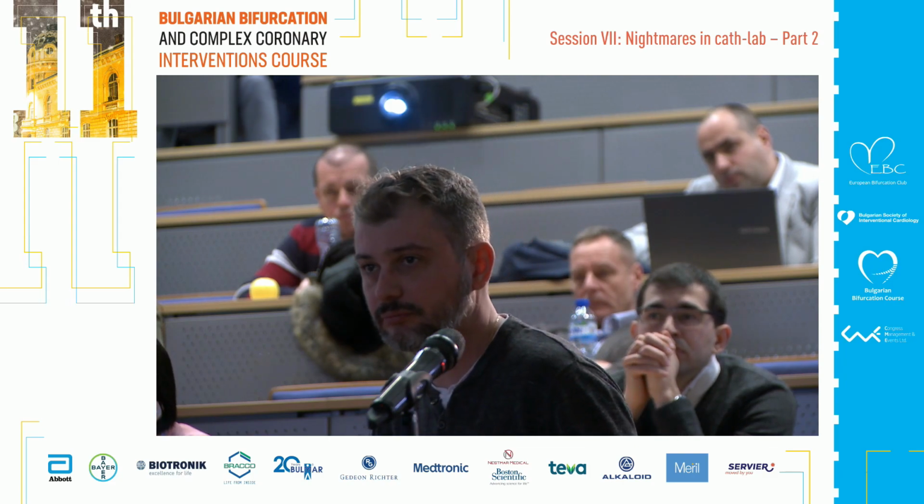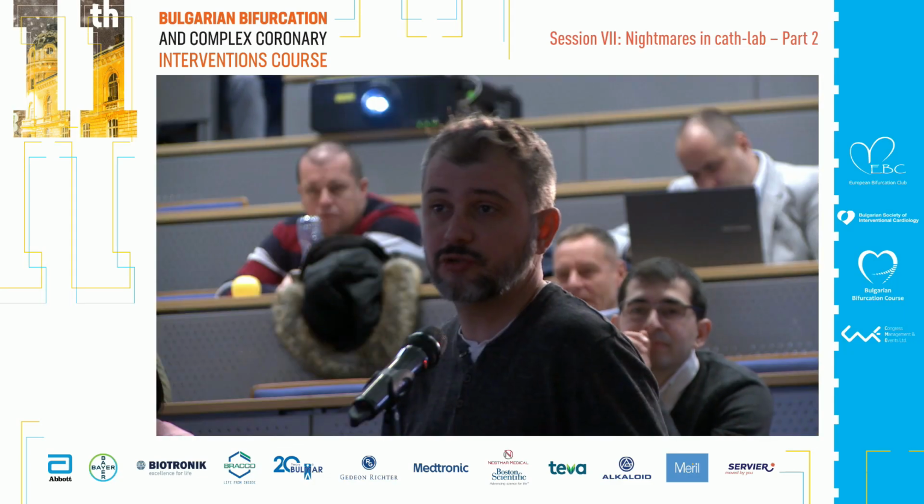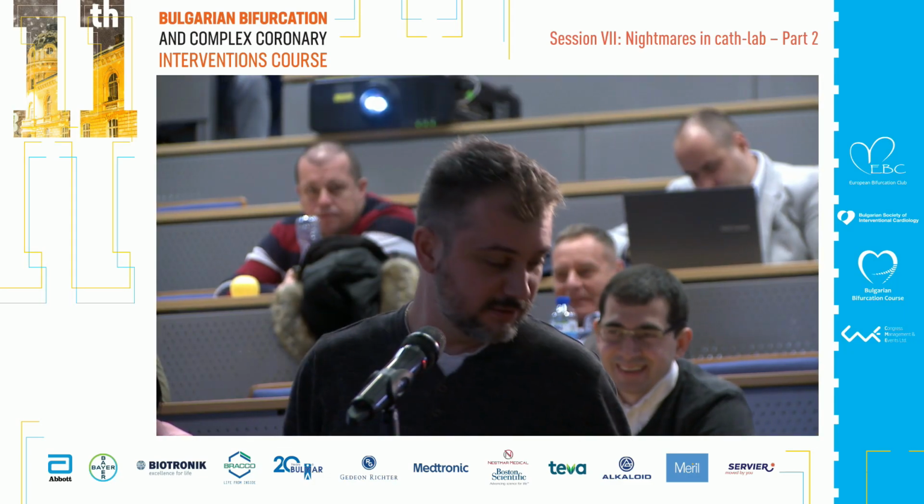And can I stress a bit further? Do you discuss that with the vascular surgeons in your hospital? Of course, we did it with the vascular surgeons. What's their opinion of that? Because they usually make a very small access to this vessel, and they can easily repair that. Just curious. Well, they said, okay, let's do it, let's try. Okay, great case, thank you.